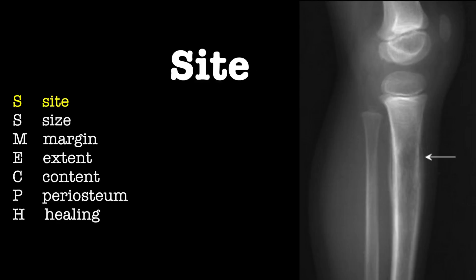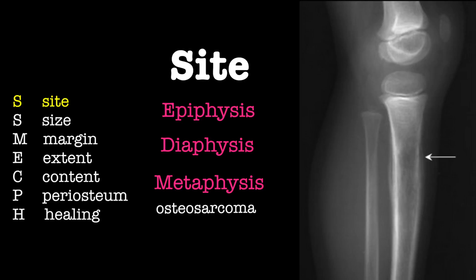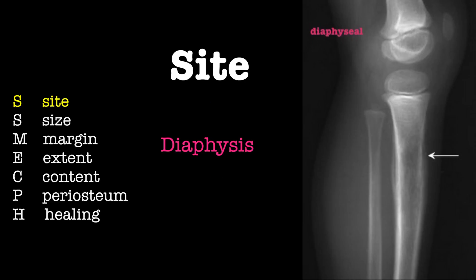S is for sight. First, determine the location of the lesion. Is it in the epiphysis, diaphysis, or metaphysis? This is important as there are lesions which usually involve certain regions, such as osteosarcomas, which usually occur in the metaphyseal region. The lesion is seen here as a diaphyseal one.